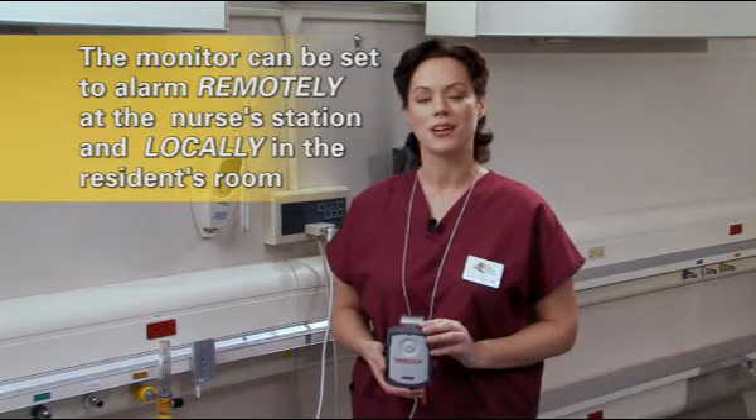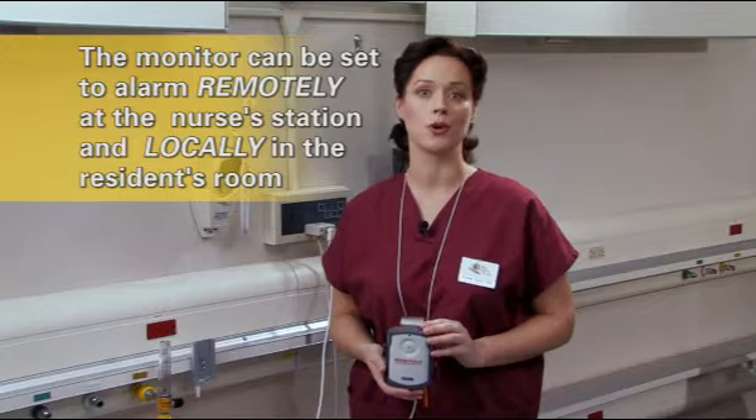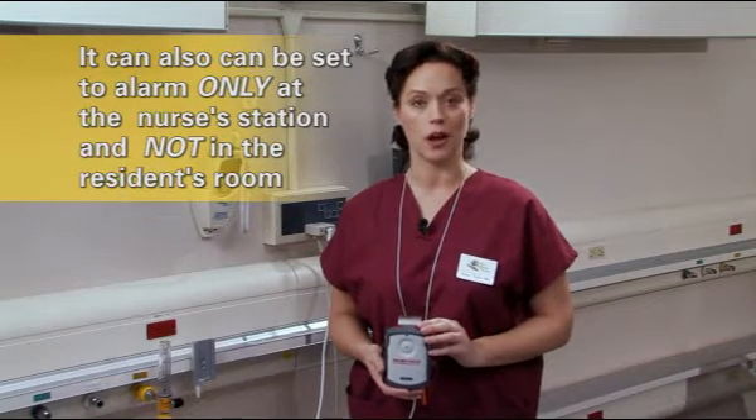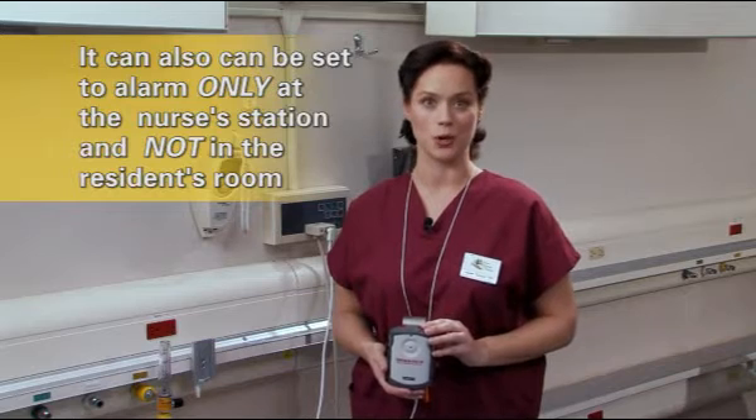The monitor can be set to alarm remotely at the nurse's station and locally in the resident's room. It can also be set to alarm only at the nurse's station and not in the resident's room. This option might be used in areas where the local alarm might bother other residents, or the monitored resident is agitated by an alarm sounding.